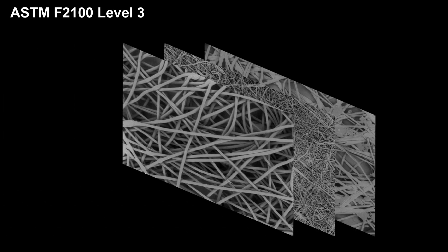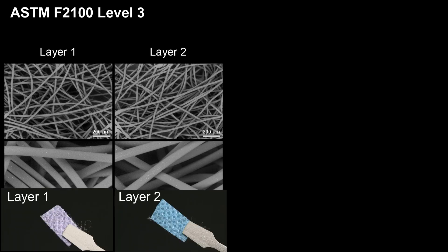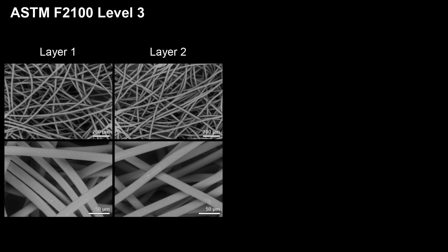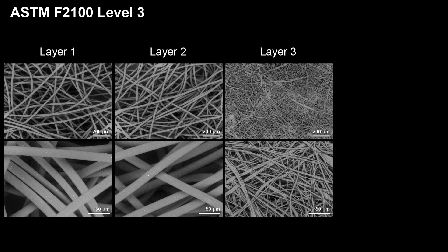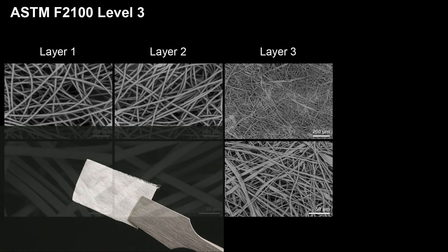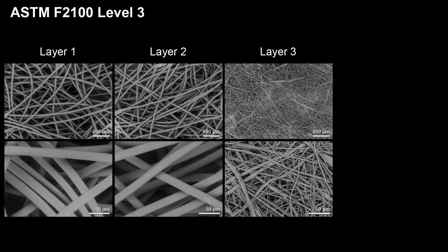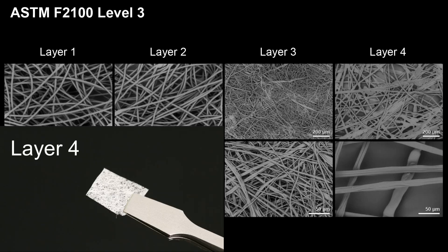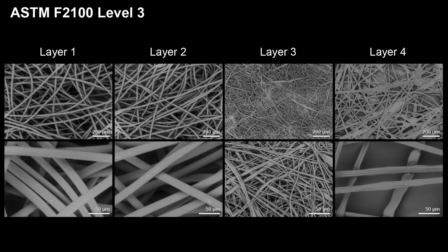Now let's look at the level 3 mask. It is made of four layers. The two layers on the top are basically the same with no noticeable structural differences. The additional top layer is likely a contributing factor in improving the fluid resistance compared to the level 1 mask. The fiber diameter of these two layers is about 19 microns. Looking at layer 3, which is the main filtration layer, the fiber density appears to be much higher than the middle layer of level 1, with an average fiber diameter of about 2.2 microns — slightly thicker than level 1. Finally, the fibers on layer 4 are rather sparsely spaced and the layer is quite thin, clearly not functioning as a filtration layer.